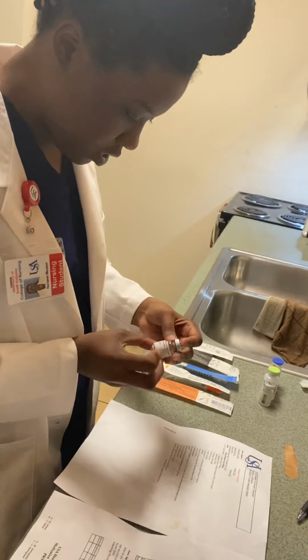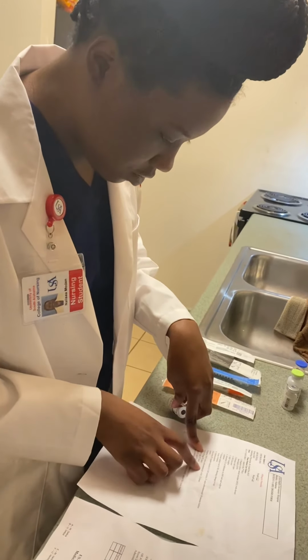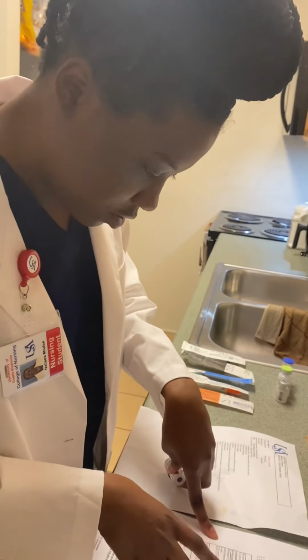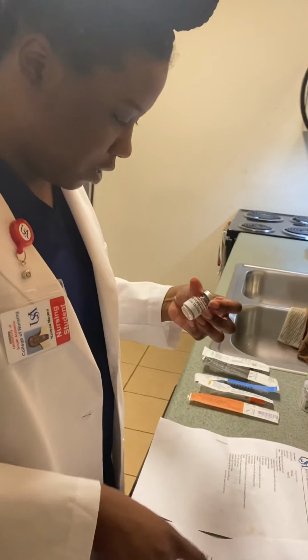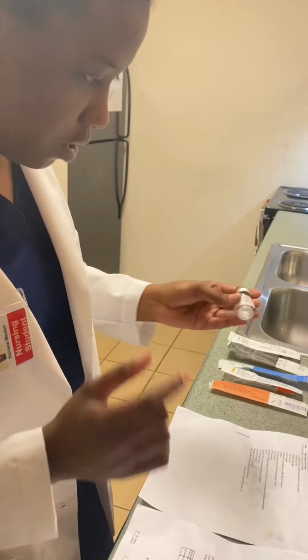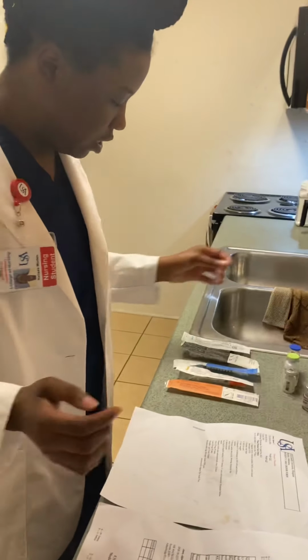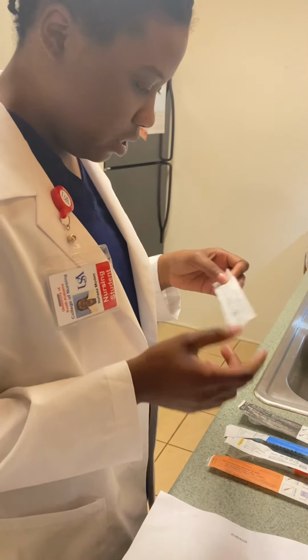So heparin 10,000 units. The order is heparin 5,000 units subcutaneously every 12 hours. So I know that since this is 10,000 units per milliliter, I will be giving 0.5 milliliters once I get my syringe. And I'm going to be using my 1 milliliter tuberculin safety syringe.